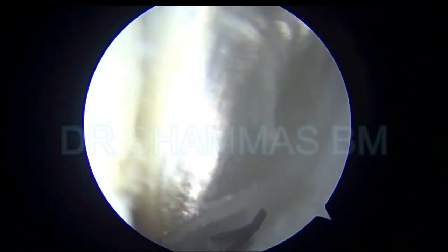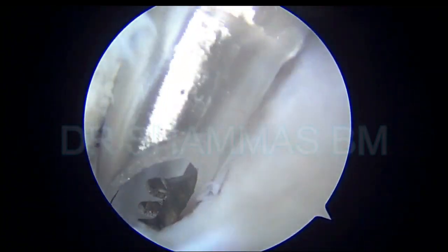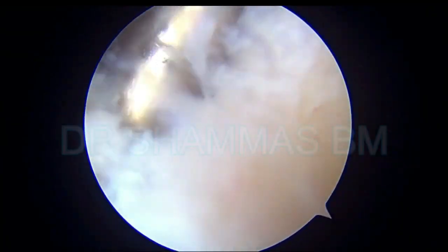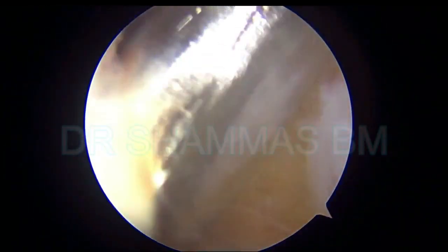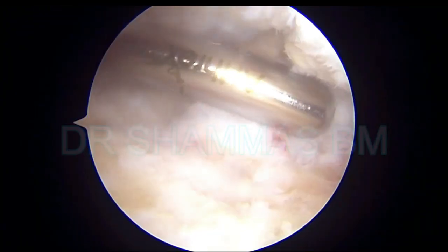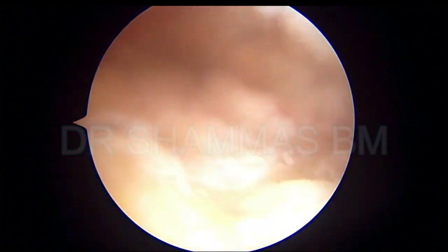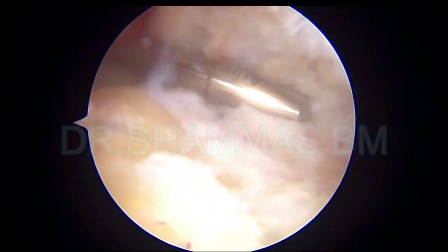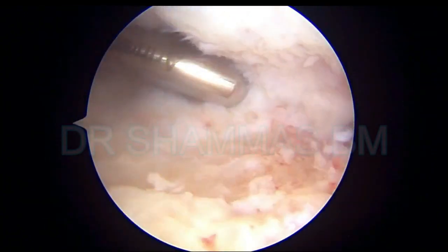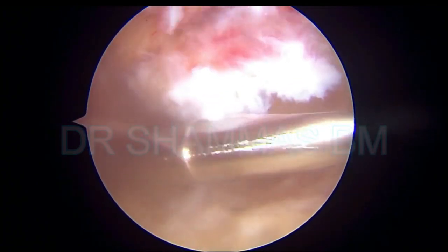Slowly and steadily we are seeing the subchondral bone. This is the lateral side — you can appreciate the fibula and the cartilage of the fibula and the lateral side of the talus. Clearing is being done there, first with the shaver, then with a bone cutter, and then with a burr. Now going to the posterior side, I am coming from the posterolateral portal, going to the posterior side of the joint. The same sequence is repeated there — initially the shaver, then the bone cutter, then the burr — you want clear bone to be visualized.